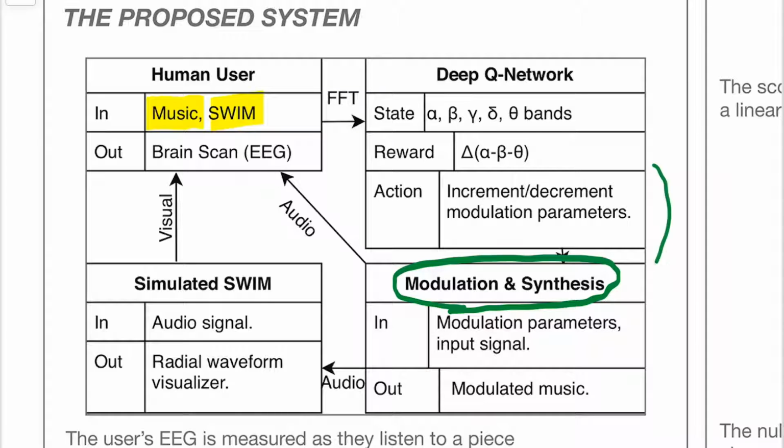The reward function for this agent is the user's meditative state as inferred via EEG. The state space, or the other information provided to the algorithm as it makes its decision, included the rest of the EEG band powers. Finally, the actions that the agent could take included incrementing or decrementing the oscillation frequency once per second.